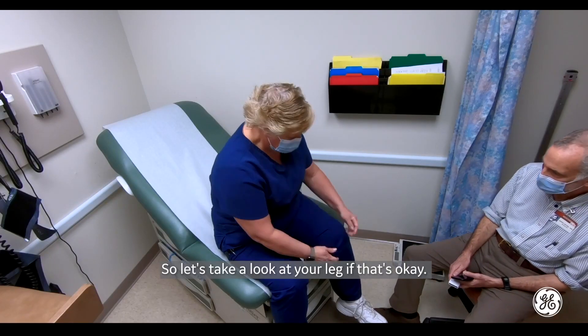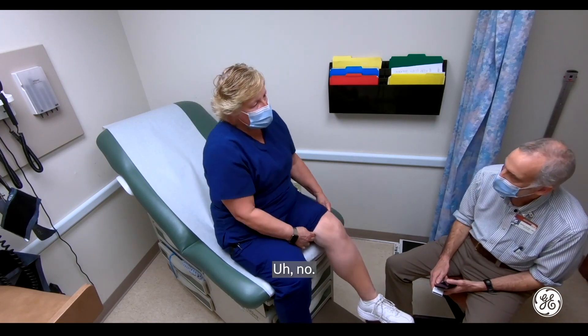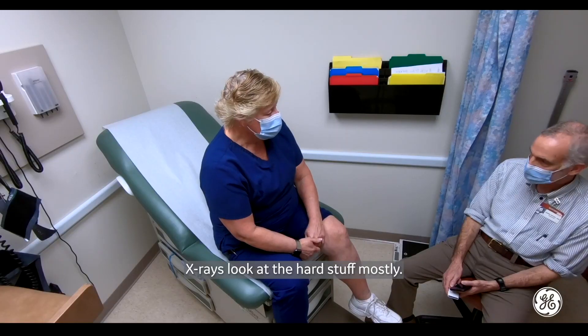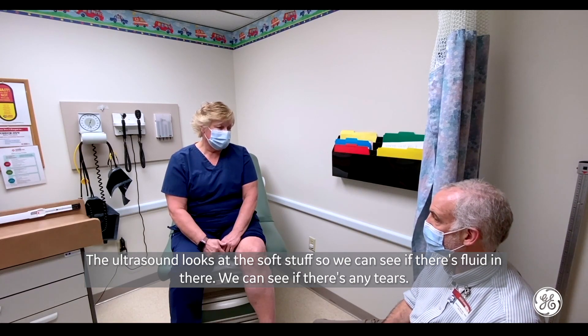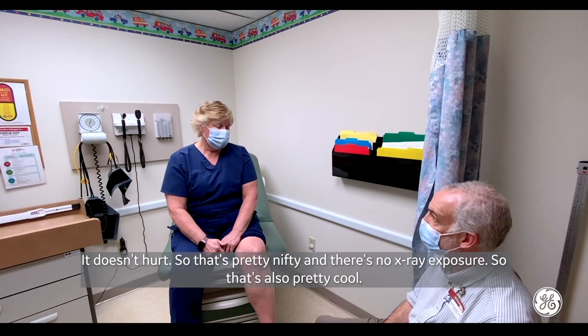So let's take a look at your leg if that's okay. Have you had an ultrasound of your knee before? No. It's a really neat way to look. X-rays look at the hard stuff mostly. The ultrasound looks at the soft stuff, so we can see if there's fluid in there. We can see if there's any tears. It doesn't hurt, and there's no x-ray exposure, so that's pretty cool.